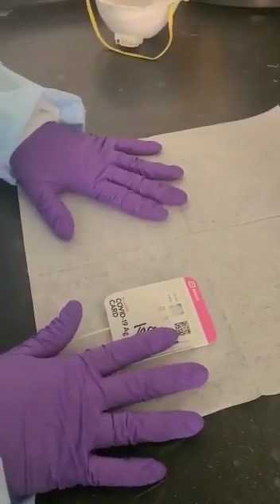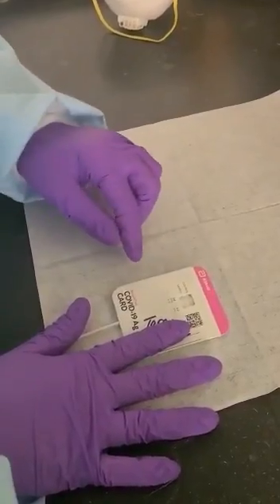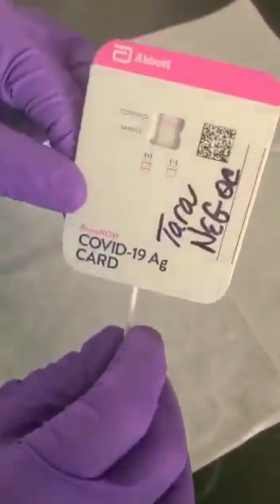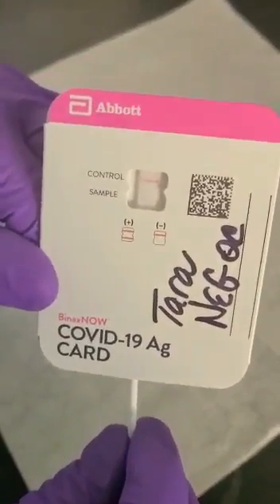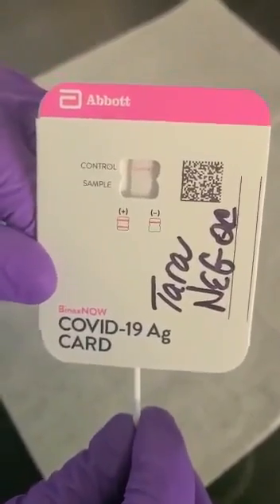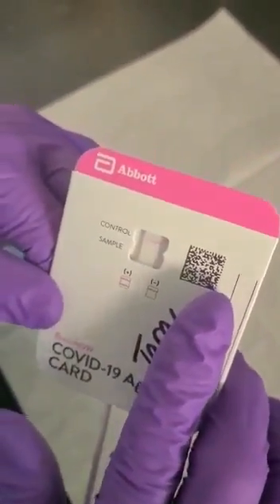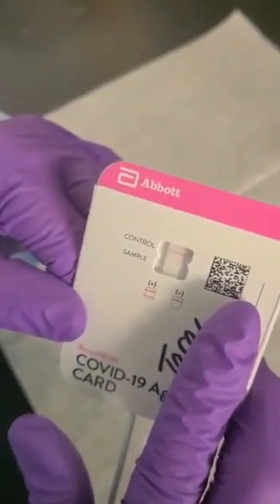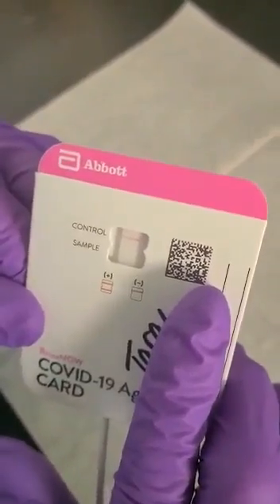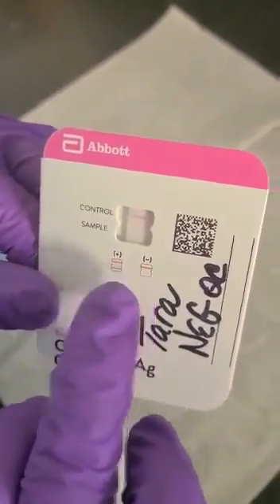The 15-minute timer just finished. What you're looking at here — I'll lift it up so you can see it a little better — the blue line has gone away, and that's what's supposed to occur. Your control line should be a pink to purplish color. I ran this as a simulation, so my sample would be interpreted as a negative result. It depicts positive and negative right here on the front of the card.